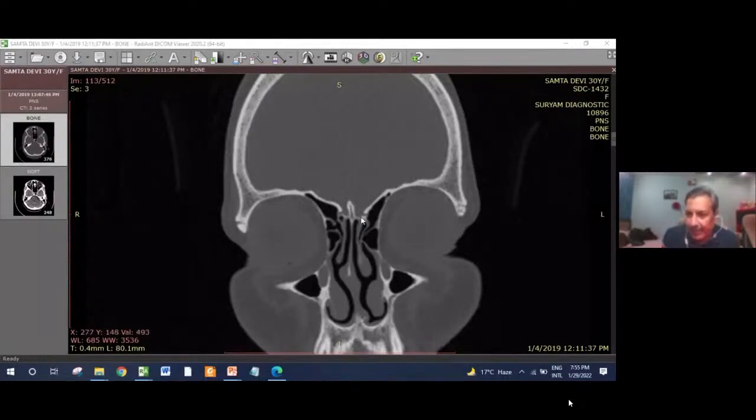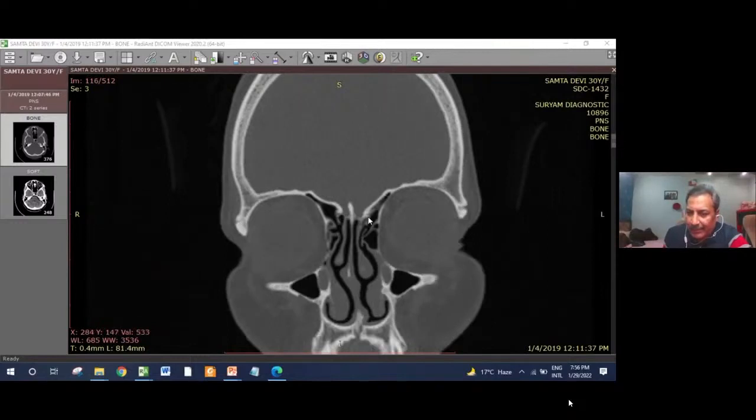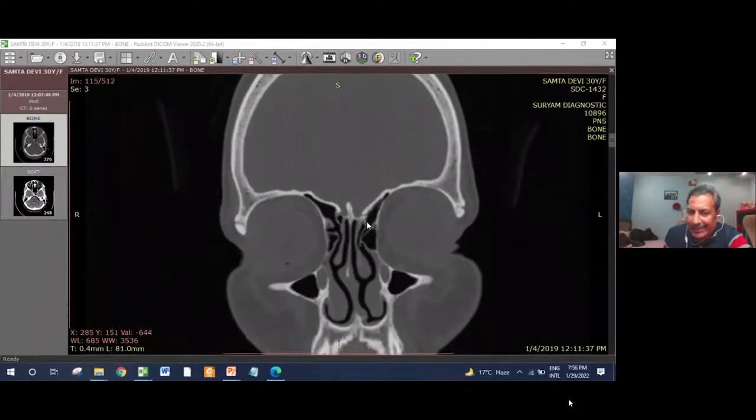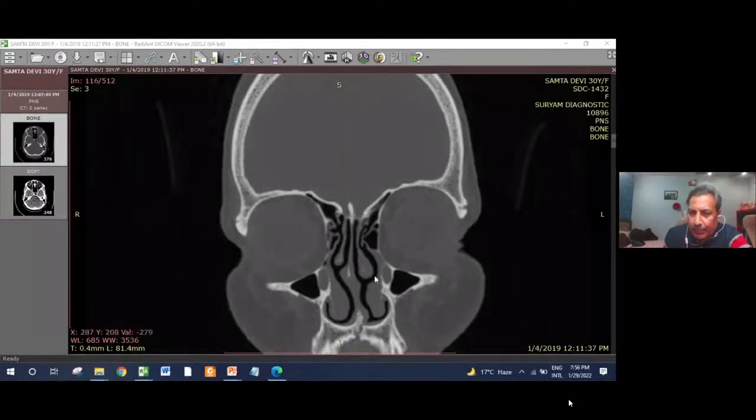Always keep the middle turbinate in view and stay lateral to it all the way, so that you don't hit the lateral lamella of the cribriform plate, which is the medial structure over here. That's a very important surgical catch point. And your radiology clearly explained how this turbinate is an important landmark to protect your lateral lamella while working in the frontal recess region.